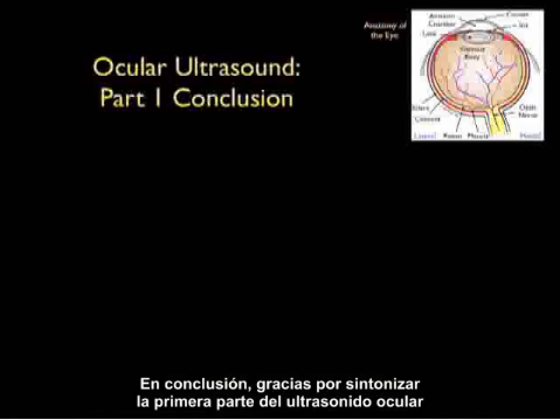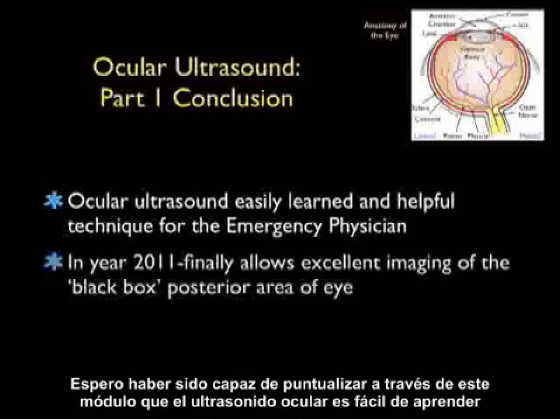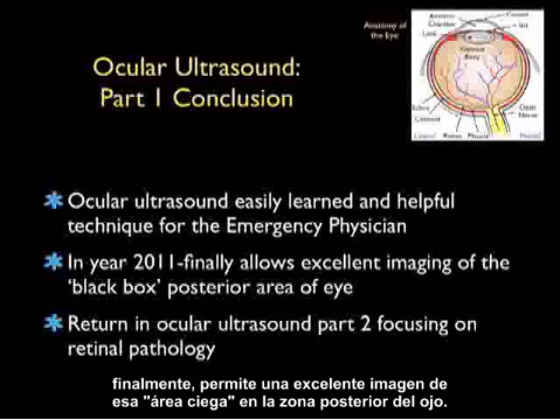In conclusion, thanks for tuning in to part 1 of ocular ultrasound. I hope I've been able to drive home the point through this module that ocular ultrasound is an easily learned and very helpful technique for the emergency physician, and in the year 2011 finally allows excellent imaging of that black box posterior area of the eye.